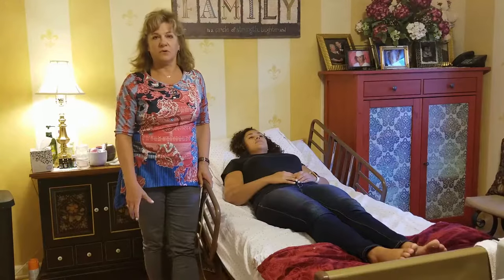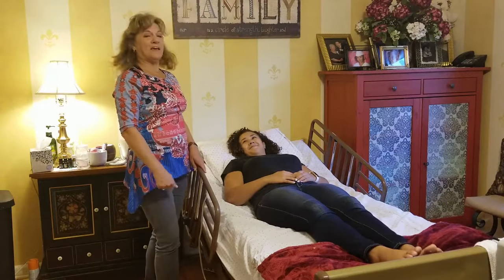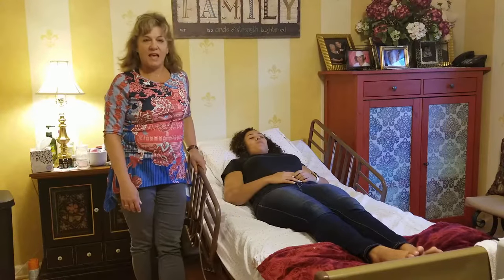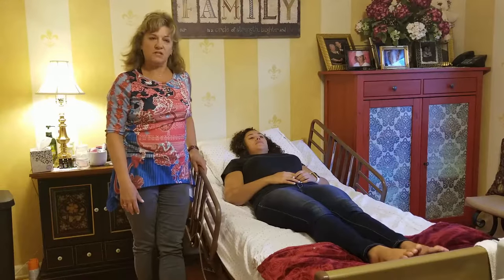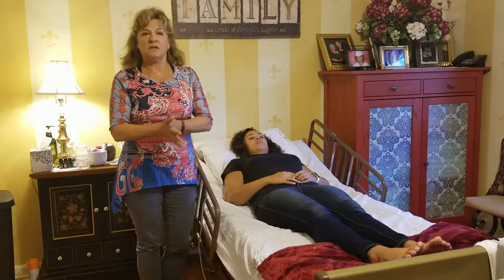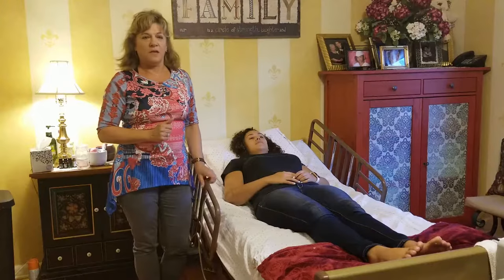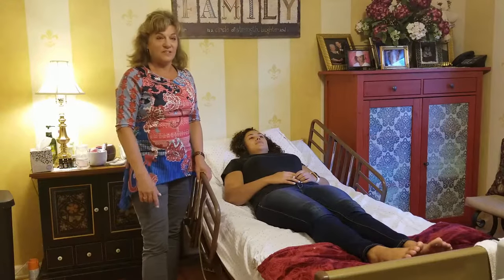I have my lovely assistant here in bed to help demonstrate the Hoyer lift. The first thing I want to tell you to do is wash your hands before you go near the patient — wash with soap and water, front and back, use hot soapy water, rinse, and dry them well. Always make sure to talk to the person and tell them what you're going to do.